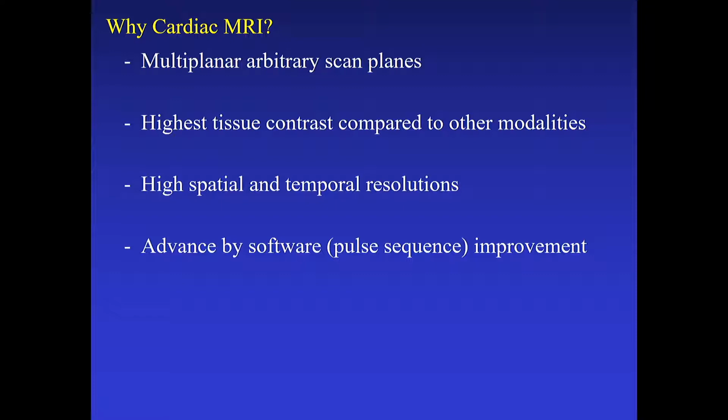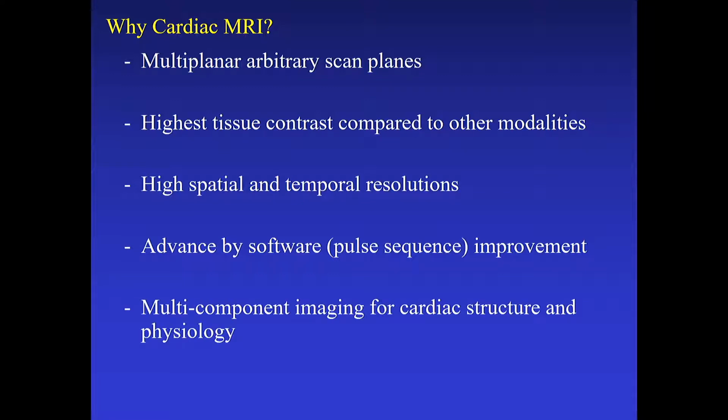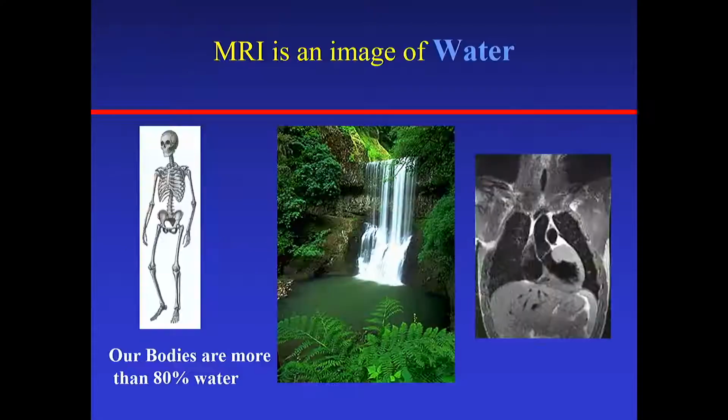So it's a software technique as opposed to just advancing by hardware. As I mentioned, MRI can assess cardiac structure and physiology in a single examination session. And also, MRI, of course, does not require the use of ionizing radiation.